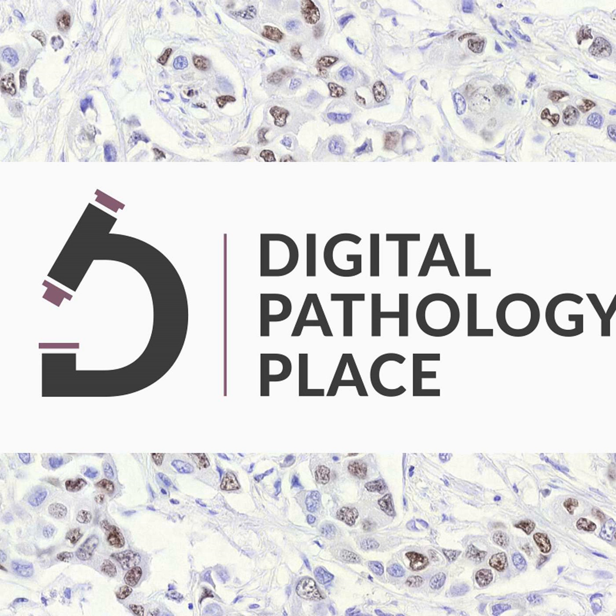And they use different areas, 1 square millimeter and 7 square millimeters of tumors. And the results, the interesting thing was, intra-method comparison showed strong consistency, both AI and pathologist assessment at 1 millimeter and 7. So strong consistency for both AI and pathologists.